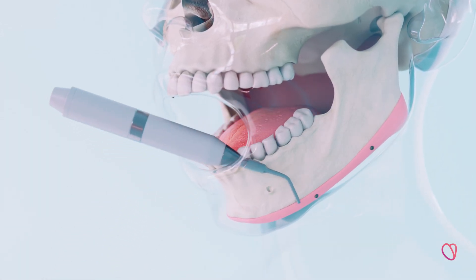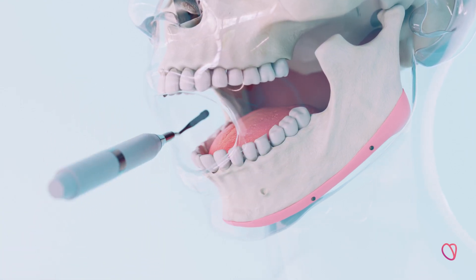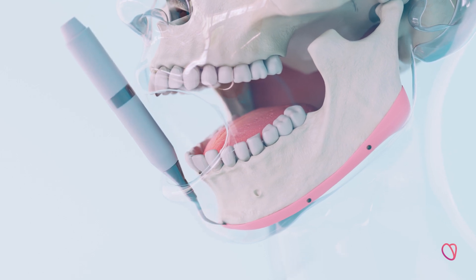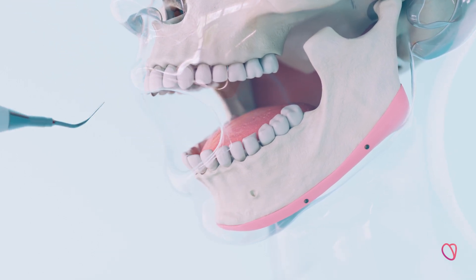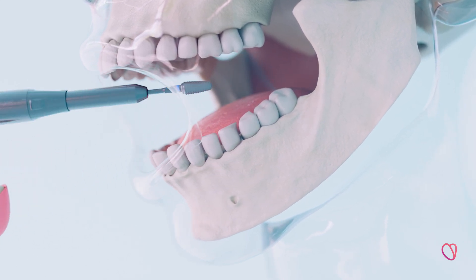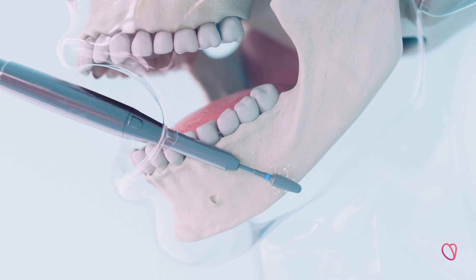Piezo surgery is a state-of-the-art portable and versatile ultrasonic instrument, which is essential for millimetric accuracy and the preservation of surrounding soft tissues, such as blood vessels, nerves, and muscle. The 3D cutting guide is removed together with the bone fragment. A high-speed burr is then used for the final shaving to leave the bone surface smooth.